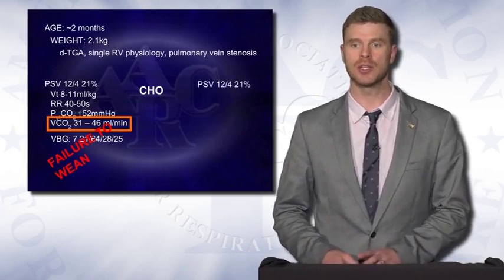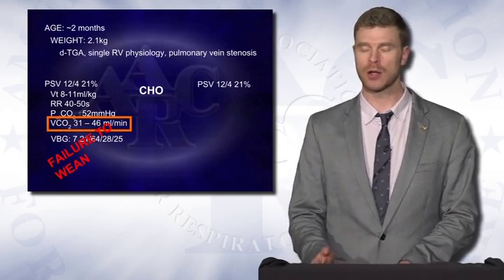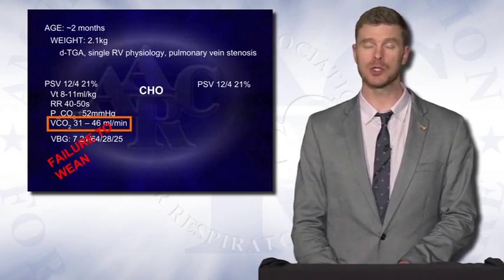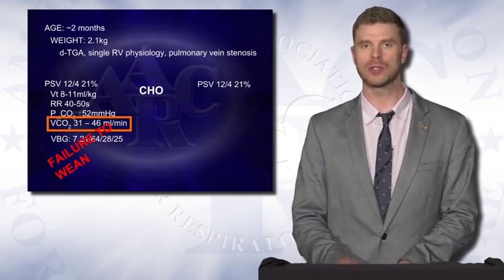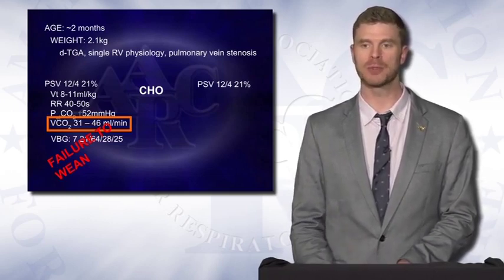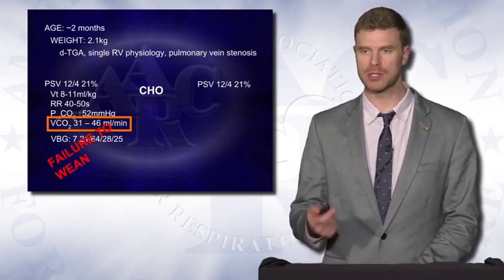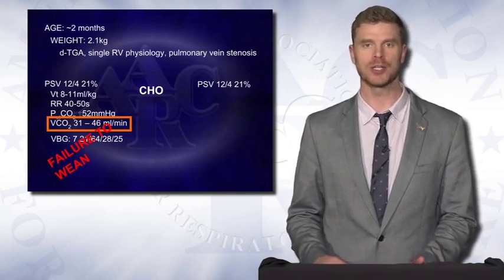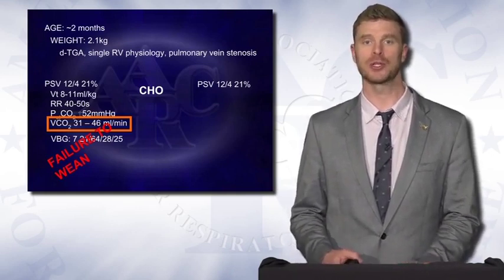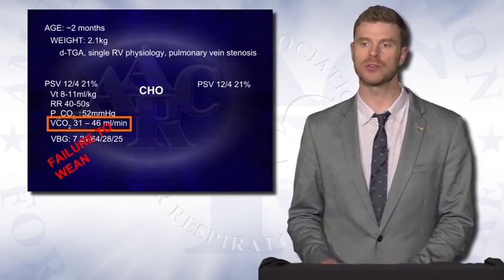So what the clinical team did was look at the actual VCO2 level. So 31, I'll just divide that in half, so 15 mLs per kilo. Remember, we're expecting this patient probably to be around 7.5 mLs per minute per kilo, so double what we'd expect. So that's a red flag. And why did that happen? Because they're on too much carbohydrates, which if you eat more food, obviously you're going to be combusting that food and then putting a CO2 burden on this patient as they try to break that down and produce more CO2.